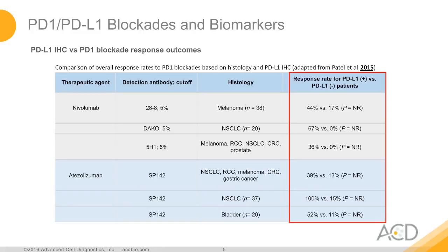So why do we see this variation using immunohistochemistry? It may fall on the use of nonspecific antibodies, inconsistent cutoffs, including mutable definitions for positivity, and tissue preparation and processing. In many antibody trials, simply looking at clinical outcomes rather than evaluating actual immune responses has made it difficult to know how to improve the approach. One of the many things one must consider are the antigens present. To accomplish this, a cell-specific and sensitive approach is indispensable to tease out these previously used response parameters that have been quite incongruent.